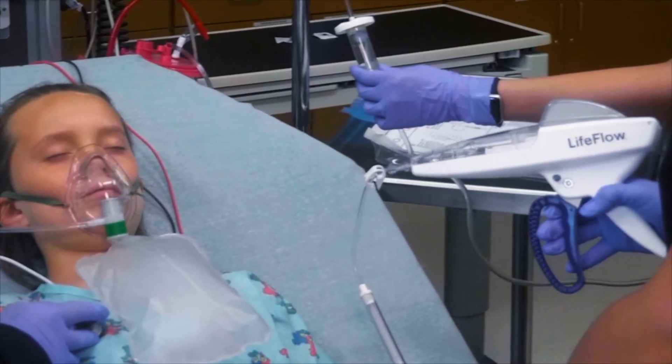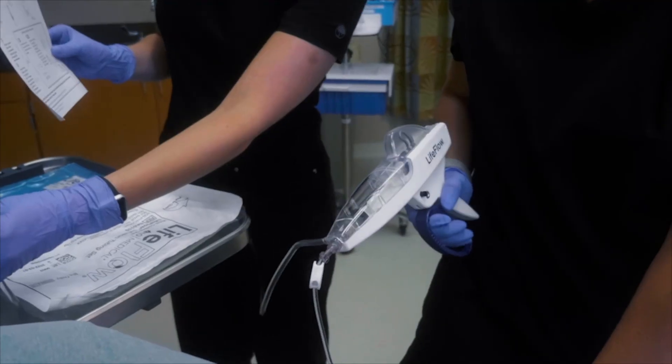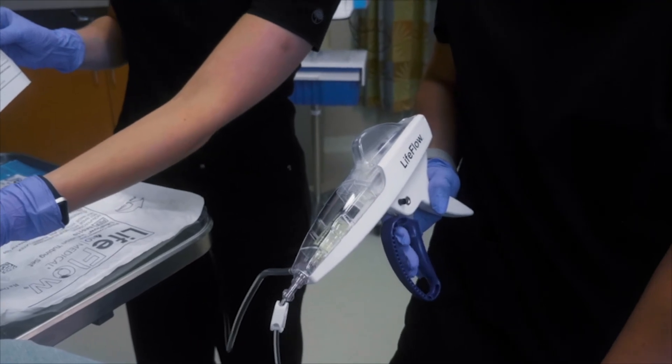In addition to improving aseptic technique, LifeFlow is faster and easier than push-pull.